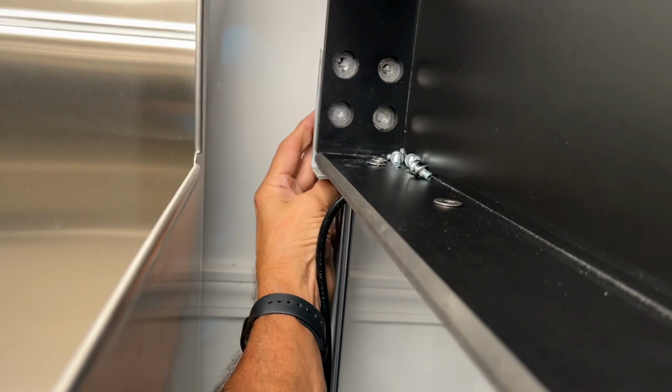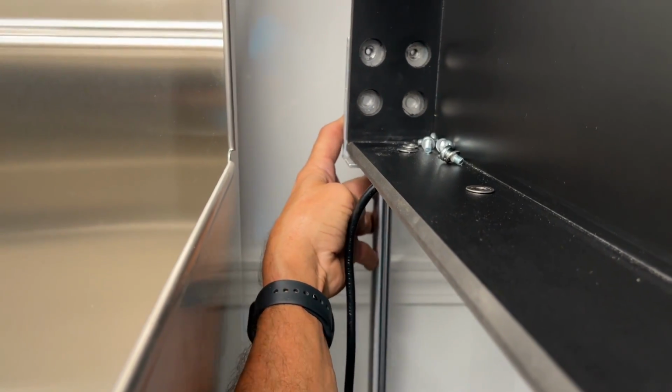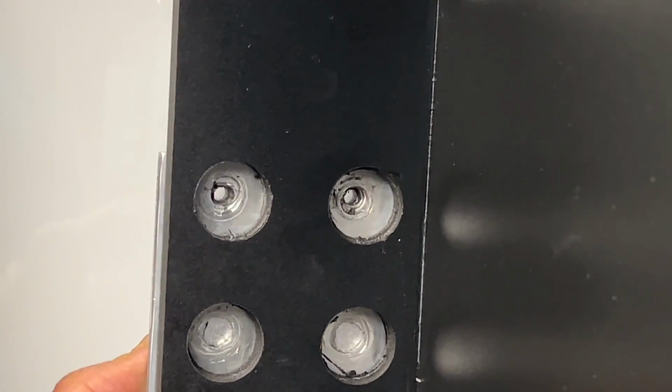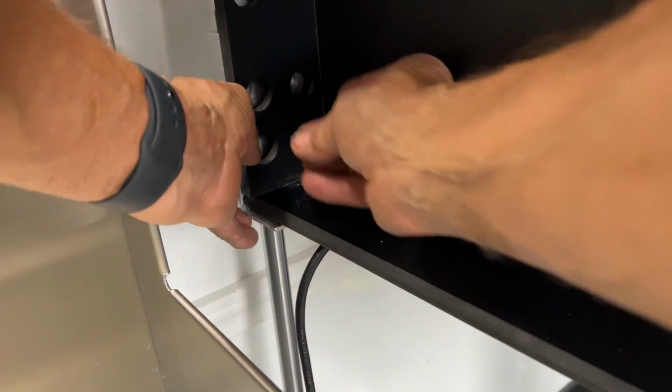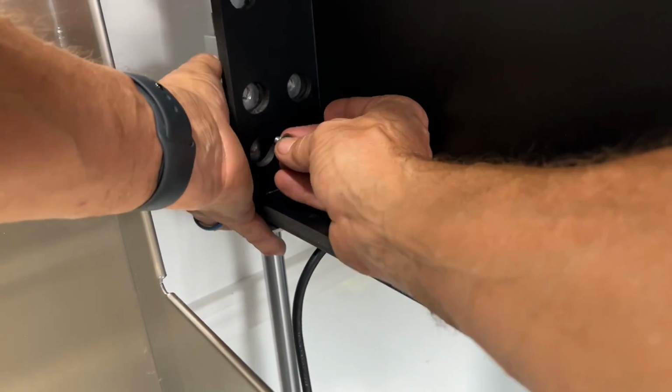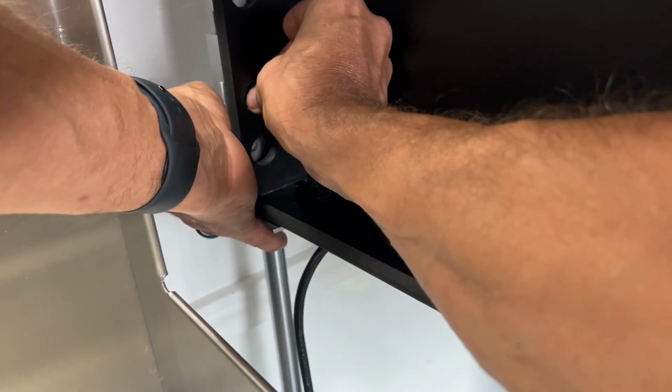And the reason we didn't put the rail into the flange is because we need to be able to move the rail from right to left to help line up this first screw hole, like you see here now. And we want to put just one screw into that first hole, or whichever one we get a good alignment.